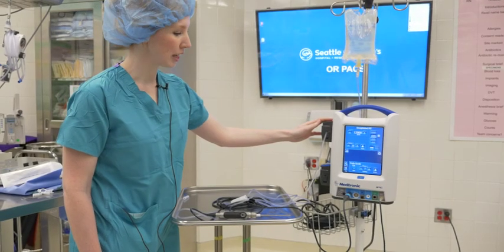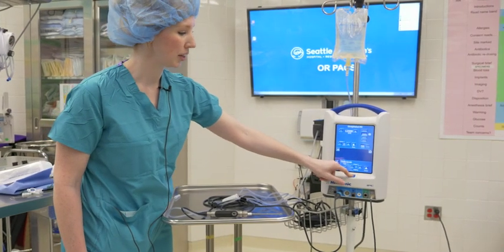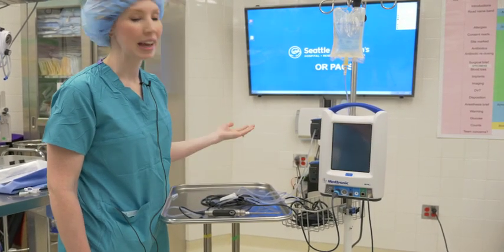And then finally, to power down the Medtronic console, you simply hit the blue button, and then you can unplug it.